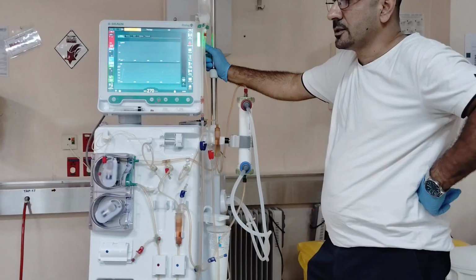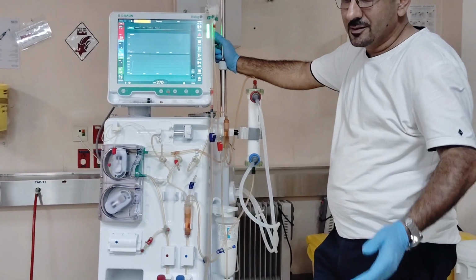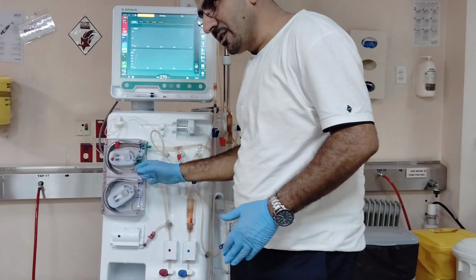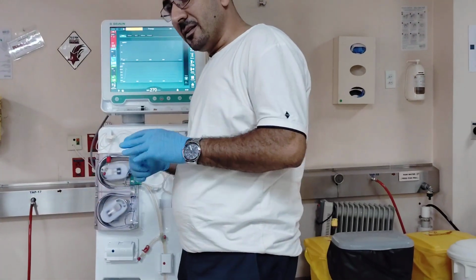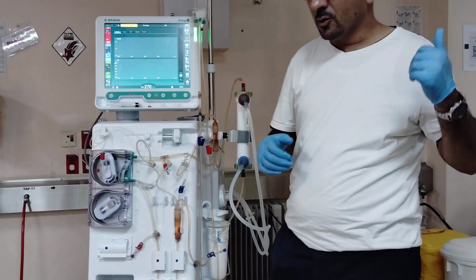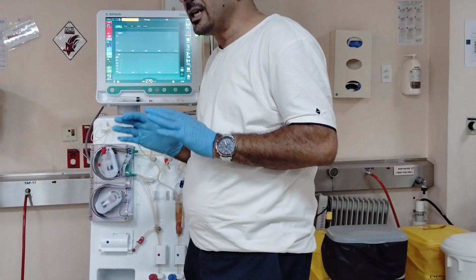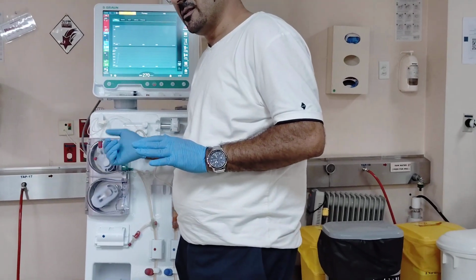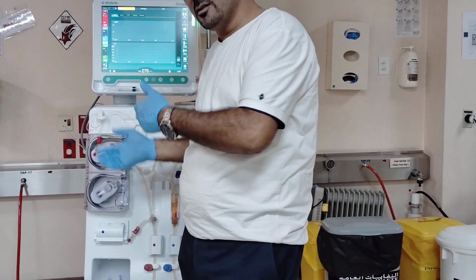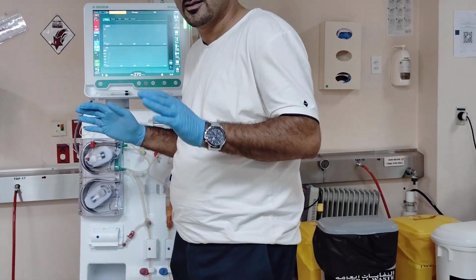Here for changing the line, we have the regular way, which is just to remove the line and put in the new one while the therapy is running, the same way we do with the old one. But make sure it is done in a safe way. For this system, yes, suppose you have a clot, even the same thing can be done.